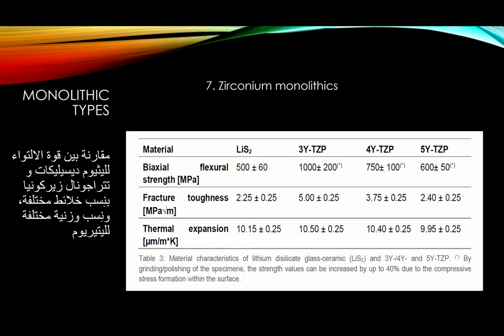We're still talking about this block from Ivoclar Vivadent, which is Emax ZirCAD, like I indicated before. Zirconia block. Still, they call it Emax, but it's a zirconia block. Emax ZirCAD, zirconium block from Ivoclar Vivadent, when we're taking it as an example. Look, this is pretty much roughly the averages.